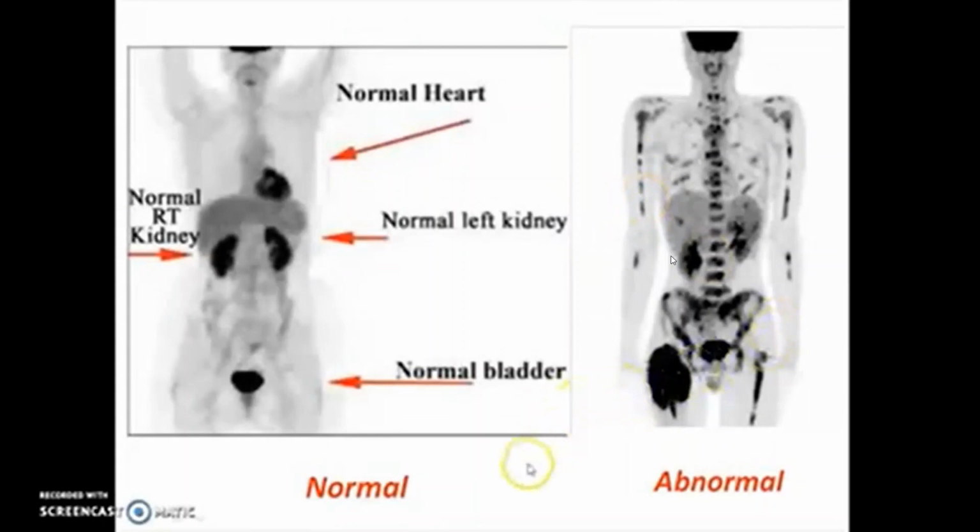Now let us see a couple of images, how PET images look. This is the normal image. Have a look here. The normal appearance of the kidney, liver, bladder are seen. Look at this. The isotopes are taken up in various vertebrae, even in the limbs, the pelvic bones. You see that's a big mass. So wherever there is a change in the metabolic aspect, the accumulation of activity is going to be there. So you can pick it up at the earliest stage. It's a very sensitive modality.